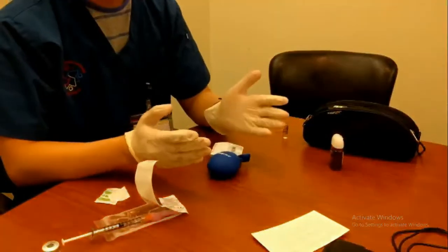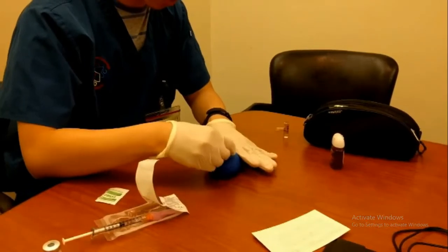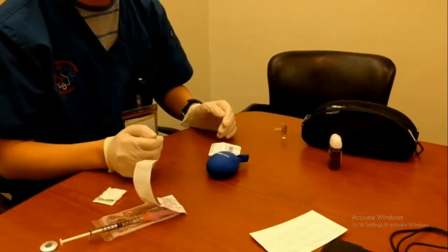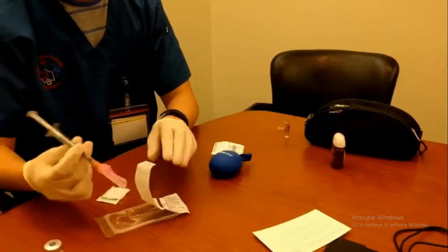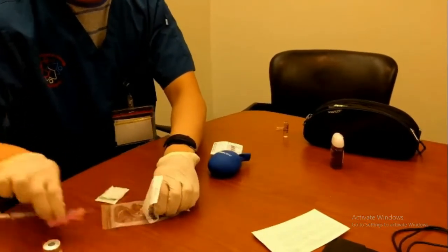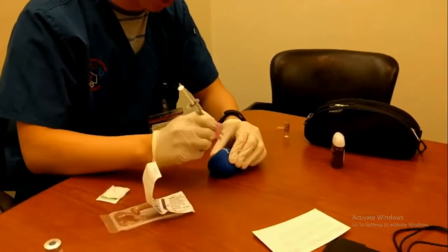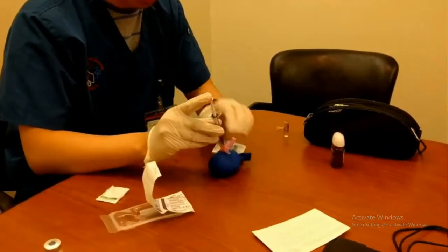Okay, so for the subcutaneous injection, first I will begin by taking the alcohol swab and swabbing. After landmarking, I will swab from the inside out to cleanse. So I'm just going to let that dry, so then there's no alcohol going into the injection site. So I'll be taking the needle, taking the shield off, removing the cap, and I'll be going in at a 45-degree angle, but first I'm going to pinch because this is the technique that is used for subcutaneous. And I'll just be going into the injection site, like that.